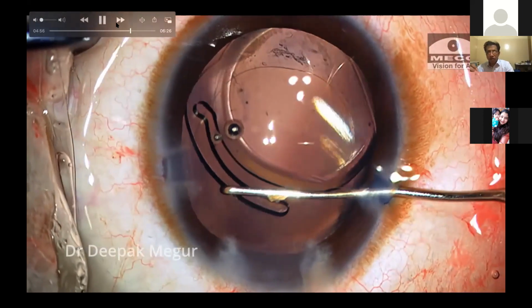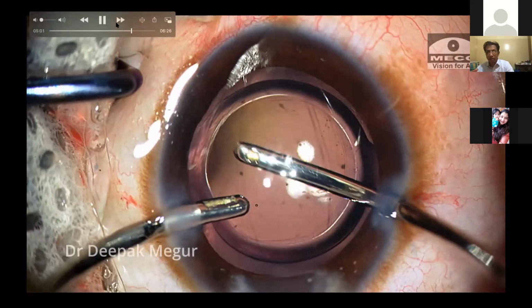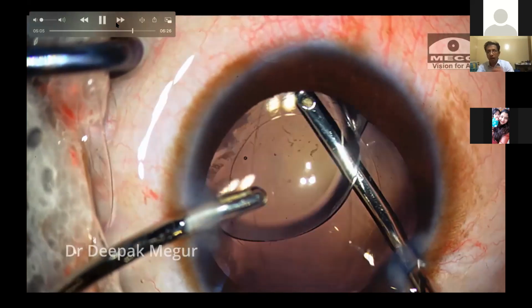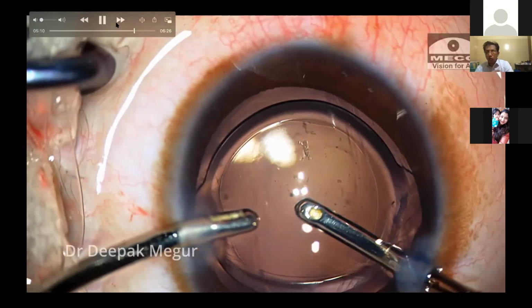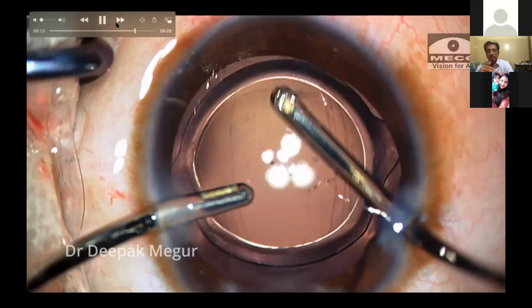And again, I'm using the same designated single piece lens which was scheduled for this patient. I placed the lens into the bag with the haptics oriented away. Again, with a low bottle height and extremely low flow rate and vacuum, I could remove every bit of visco which is in front and behind the lens as well.